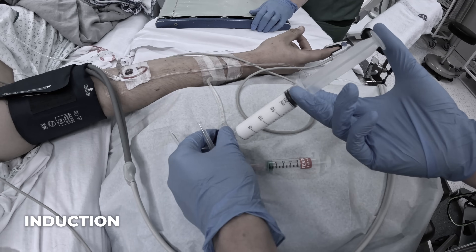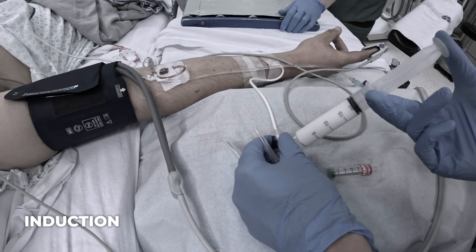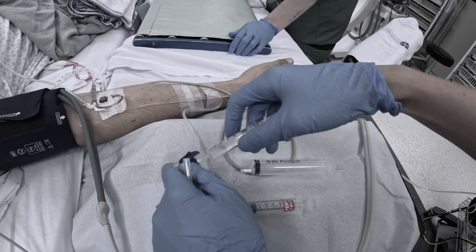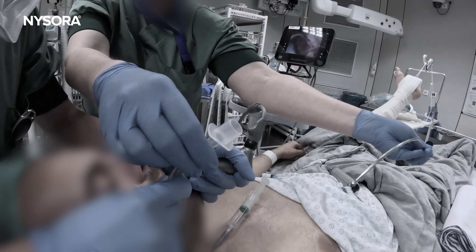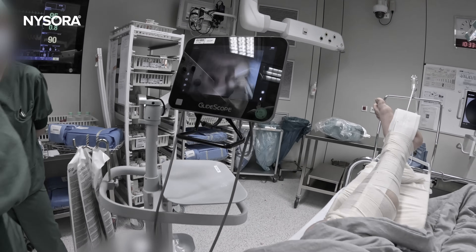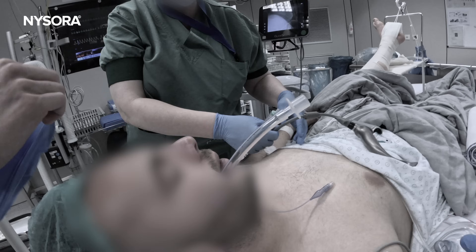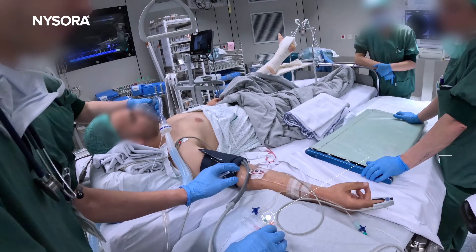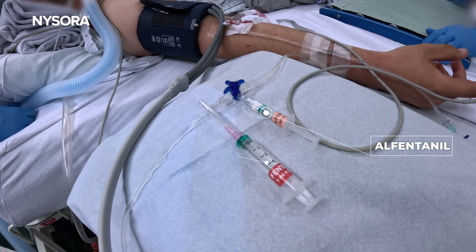Let's move into the induction phase. We start with 200 milligrams of IV propofol immediately followed by muscle relaxant to ensure a smooth and quick intubation. Given the risk of aspiration, we perform a modified rapid-sequence intubation. This minimizes the time the airway is unprotected, which is key in patients with a full stomach. Remember, we want to move fast, but not rush.